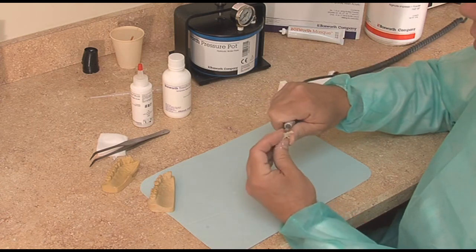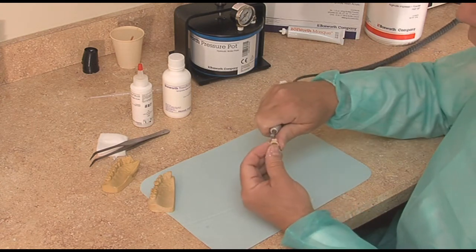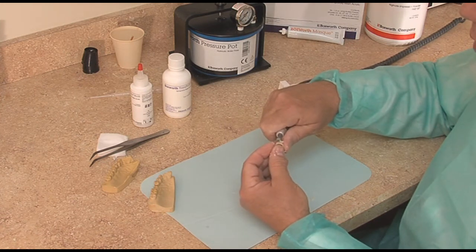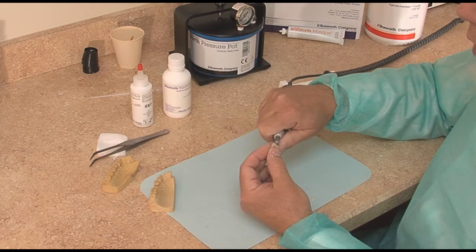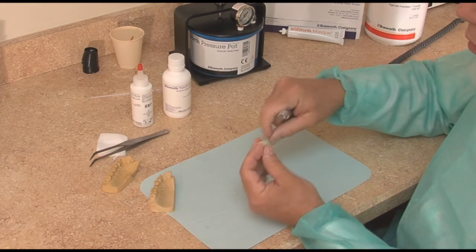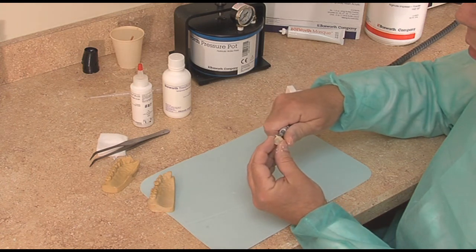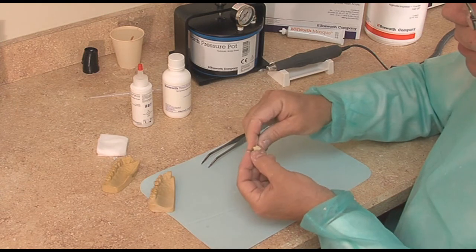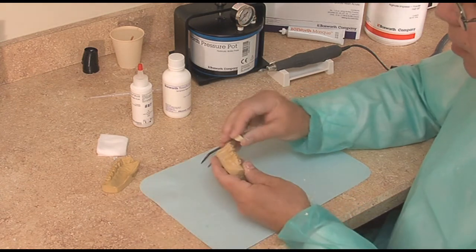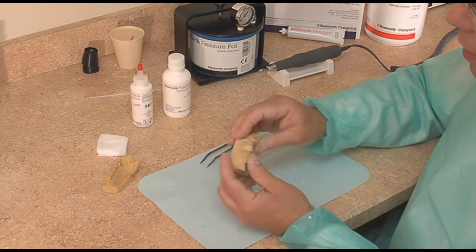You can see how nicely it cuts. I don't want to lose the interproximal contact because I want to keep it stable so the teeth do not shift at all. You start trimming it, clean it out, soap it up, and then come back to the mouth and fit it. Generally we get a very nice fit.